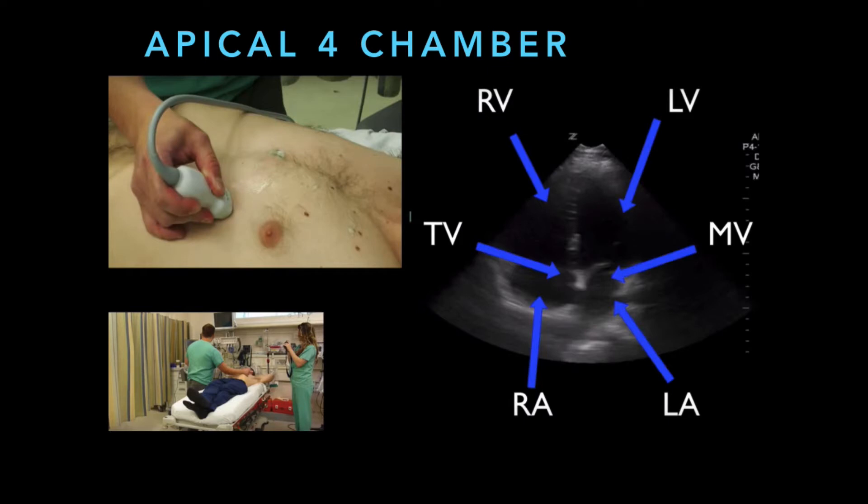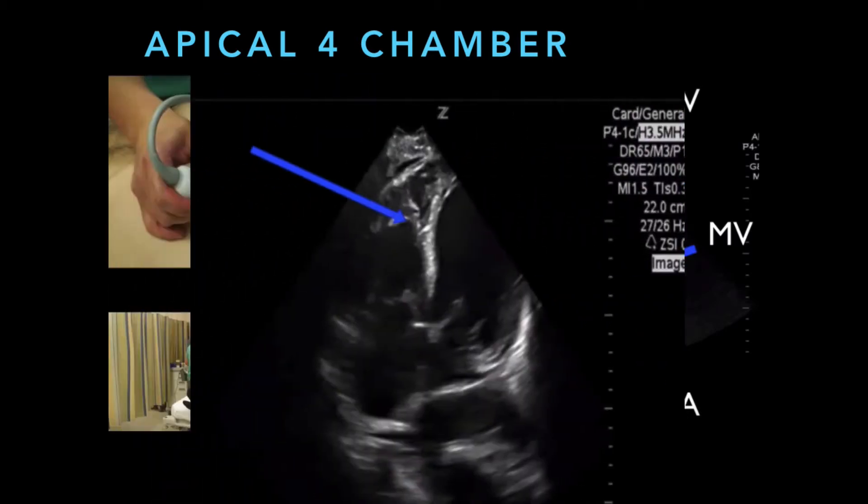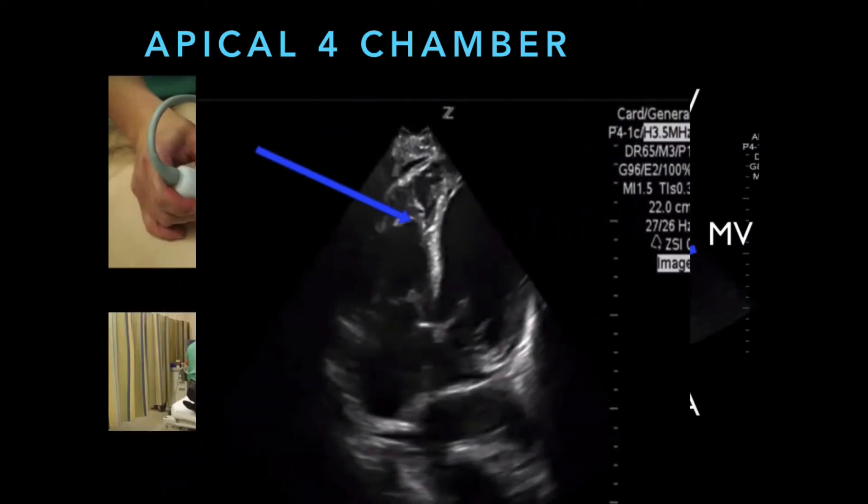You can see the left and right ventricle, left and right atrium, and commonly the mitral and tricuspid valves. If you point the ultrasound a little bit more anterior in the chest, you can often see the aortic valve as well. That thing that the arrow is pointing to is called the moderator band — it's a part of the right ventricular muscle in the apex of the heart. Sometimes you may get confused about what's the left and right heart, especially if chamber sizes are abnormal. So look for that moderator band; that is a telltale sign that that's the right ventricle. Also, the tricuspid valve is a little bit closer to the apex of the heart than the mitral valve.